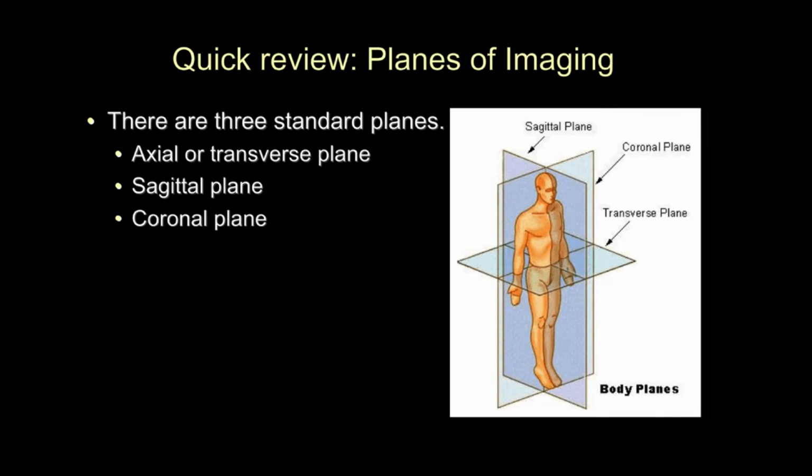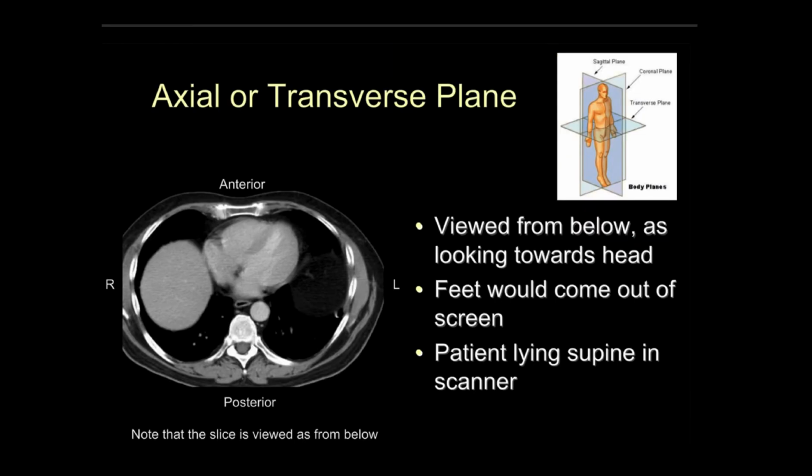And just a quick review, there are 3 planes of imaging. There's the axial plane, sagittal, and coronal. I'm going to fly through some of this information fairly quickly, and I will send these slides out to you, so feel free to review those.